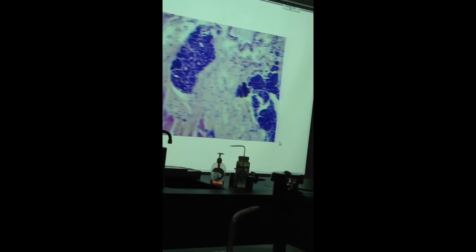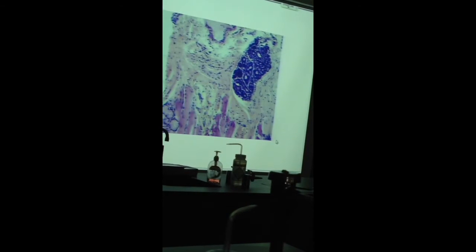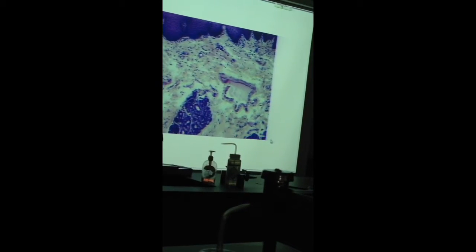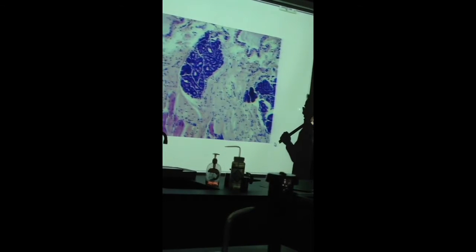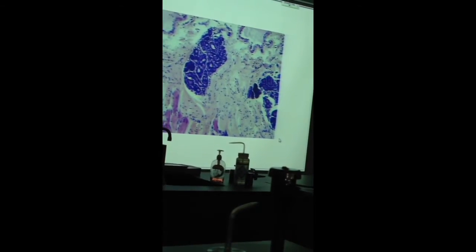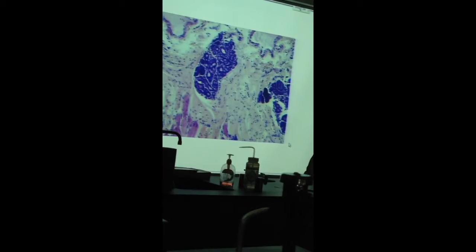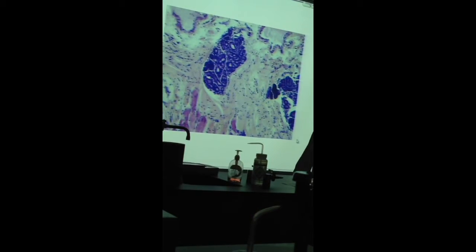We also see some other things associated with the tongue here in the connective tissue, which is deep to the epithelium. First of all, these purple stained structures are clusters of cells. Now these cells are serous cells. We're going to see two types of cells in salivary glands. These are part of the lingual, the sublingual salivary glands. As I said, all salivary glands secrete saliva, but the consistency of saliva varies depending on the ratio of cells, serous to mucous. Now these are serous cells. They're darker stained. What they do is they produce a thin, watery secretion high in enzyme. The enzyme is salivary amylase. Anybody know what amylase does?